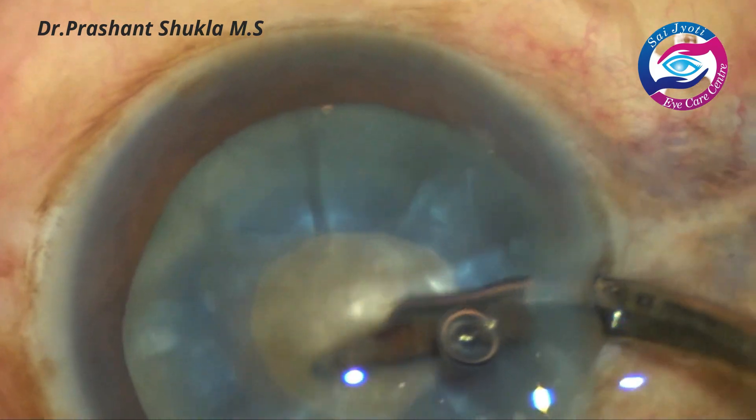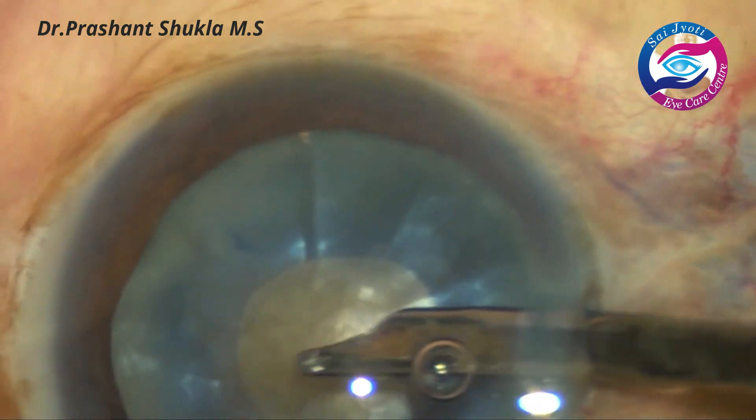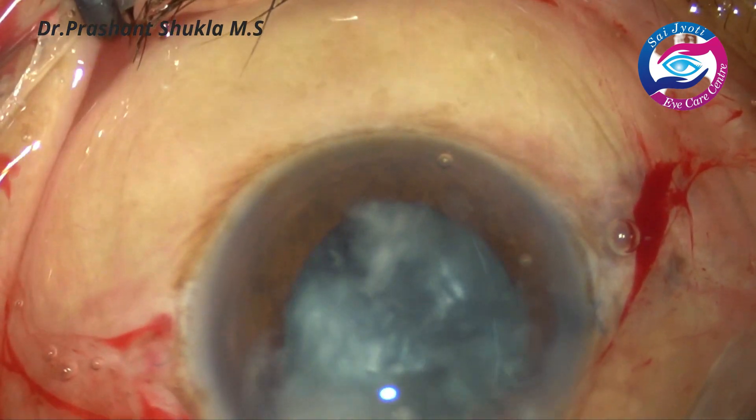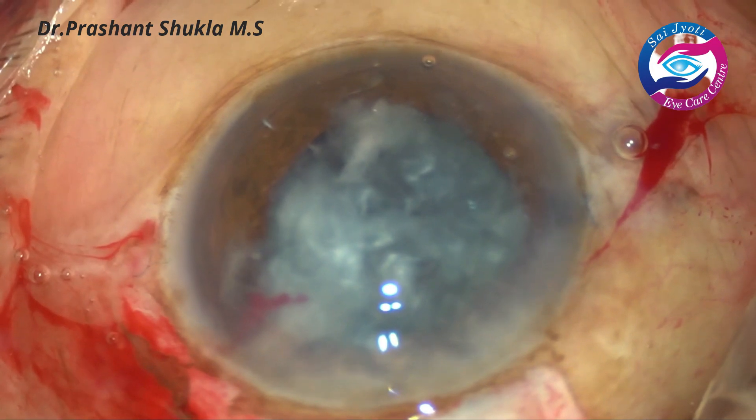After the mini rhexis, the Simcoe is used through the side port — 23 gauge — to decompress the bag, and this is how the nucleus is removed using the phaco sandwich technique.